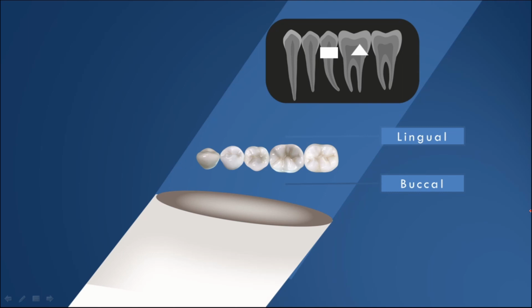So, if we give mesial angulation in the radiograph, the object which is present mesially in the radiograph is anatomically present in the patient's mouth lingually. So, in this example, the triangle is present mesially, so in the patient's mouth, it is located lingually. In this radiograph, the square is present distally, so clinically it can be found buccally. Mesial angulation of the X-ray tube, and a mesially located object in the radiograph is clinically present lingually.